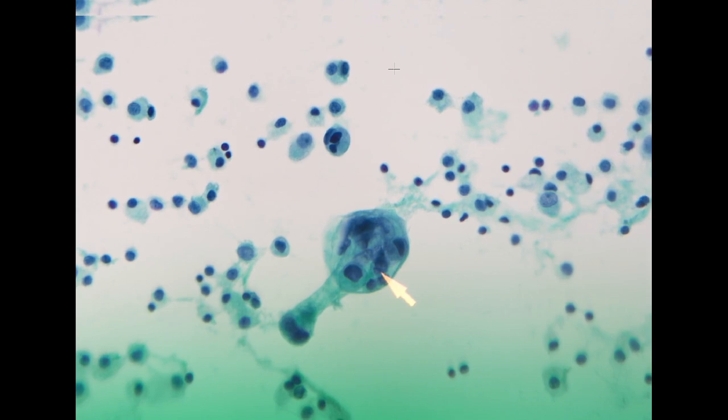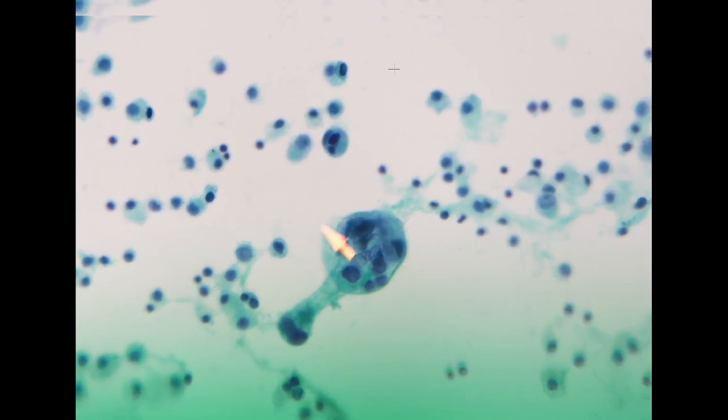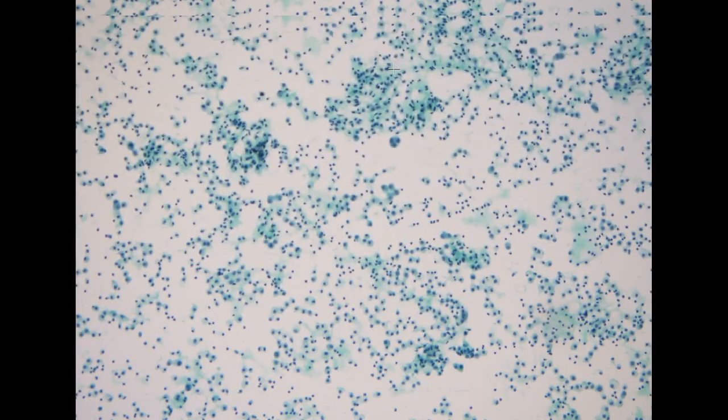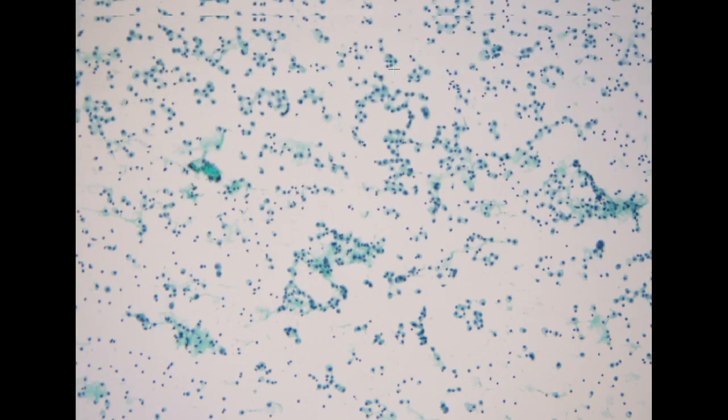The nuclei demonstrate some atypia, and it is very tight. So based on the morphology, it looks like an adenocarcinoma from a 61-year-old male. And this is probably the only cluster most convincing for adenocarcinoma. The other clusters are relatively indeterminate.